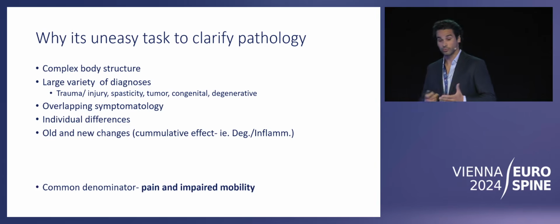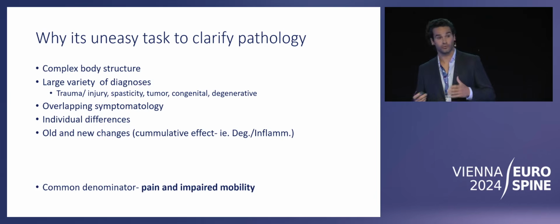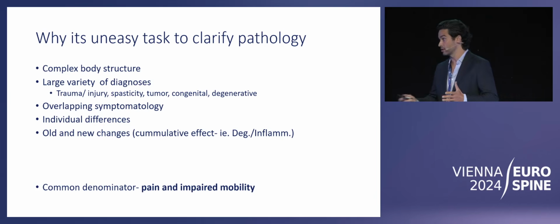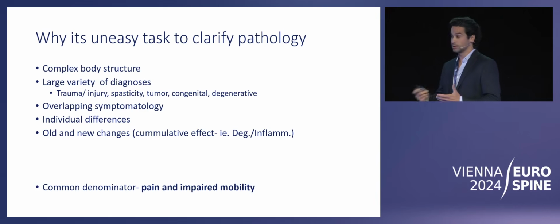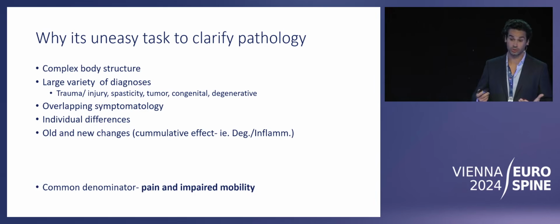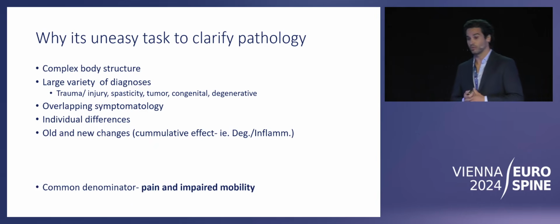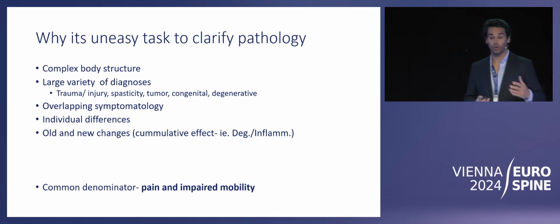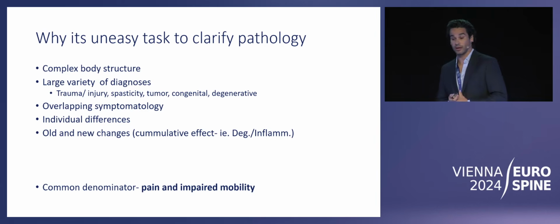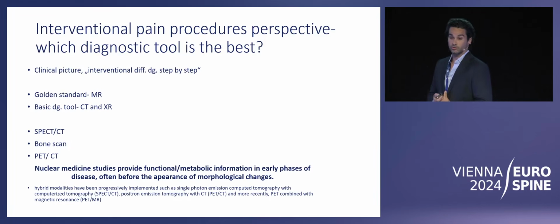And one of the most important for me is that among the usual investigations, it's very hard for us as pain physicians, having bare hands and clinical possibilities in a clinic, to differentiate between old and new changes. What is quite a fresh change in spinal pathologies, what is old? Being given this topic, it kind of came to me what nuclear medicine can bring us to see and differentiate between the old and new. The common denominator of all pain syndromes in regards of the back is pain and impaired mobility, which we can find in mostly all of the syndromes.